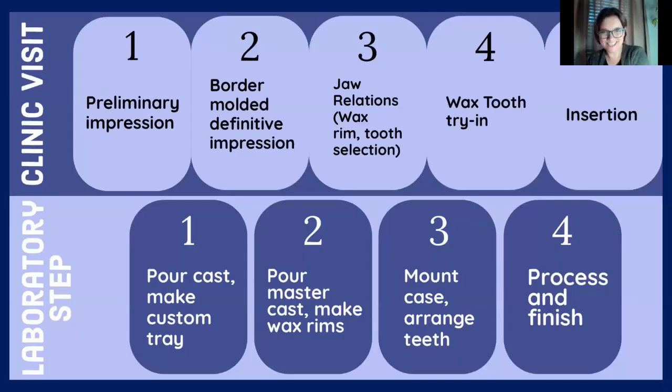So looking at the conventional denture workflow, this is what Dr. Giese taught his students in the 1920s, and it is what I teach my students in the 2020s. And everybody in between has taught the same thing. So if you have been to dental school, this is more than likely the workflow you learned.